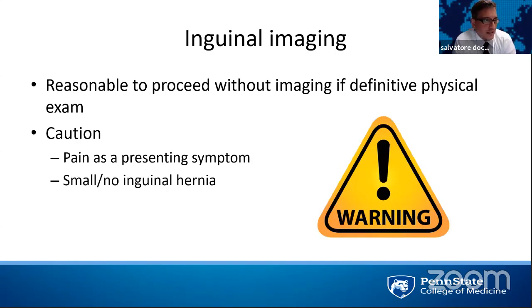Yeah, I think that's a perfect thing that you just mentioned, is the fact that we are looking for very different things when we look at CAT scans, compared to what radiologists look at. For the most part, they're going to read the hernia, what's in the hernia, and what's the size of the hernia. But like you mentioned, they're not going to mention the denervation of the rectus muscle. And I think that's a key.